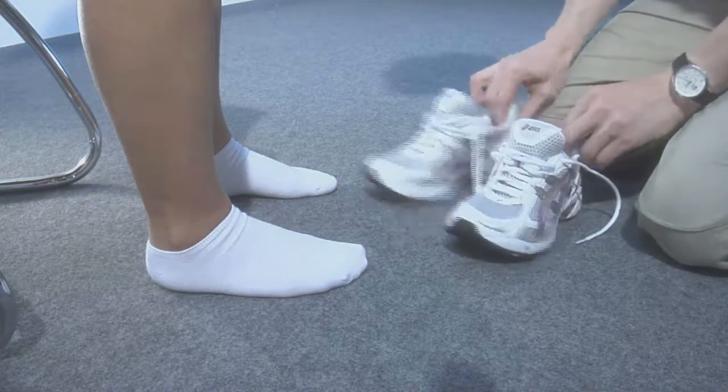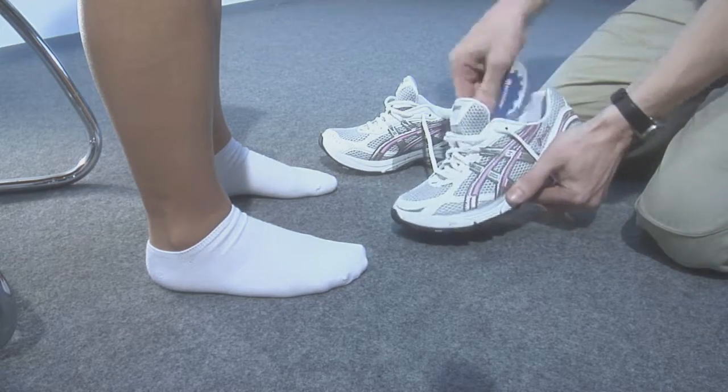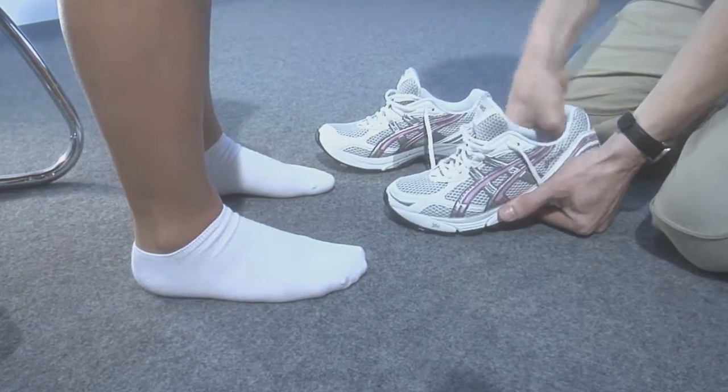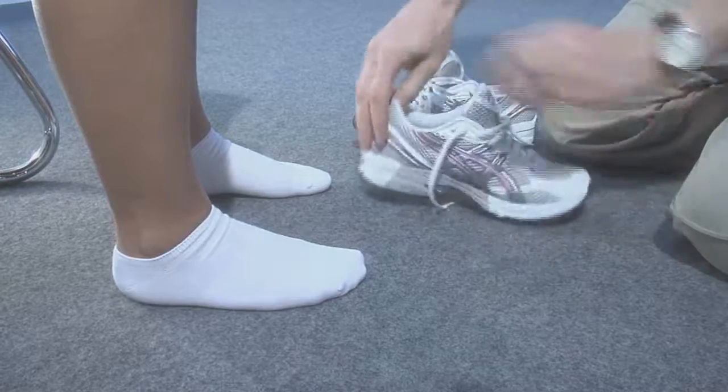It usually takes a couple of days to get used to the sensation of an arch support if it's the very first insert for your customer. In the beginning, we recommend wearing the inserts for a few hours a day.